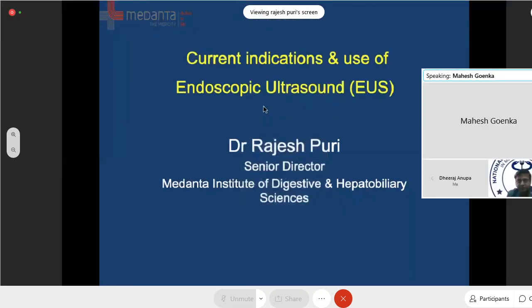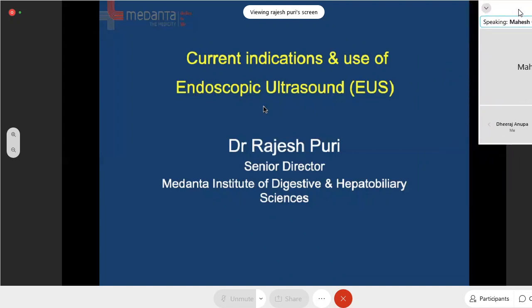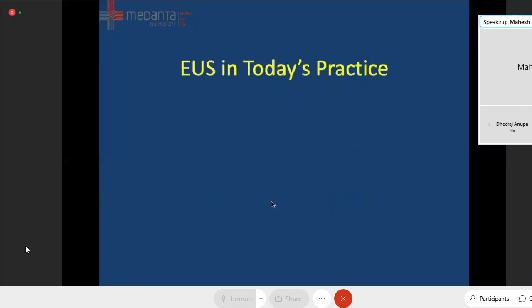So the topic today is to talk to you about endoscopic ultrasound. Gone are the days when endoscopic ultrasound is an optional part of your training or your clinical practice. Now it is an essential part of your training. It will be asked in the examination, and of course, it is a very integral part of any GI practice now. So I thought this will be the right platform to talk to you about some basics of endoscopic ultrasound.